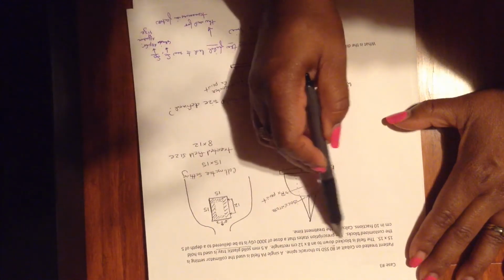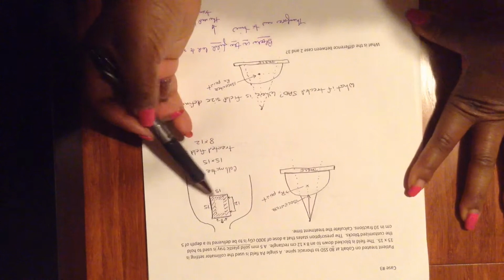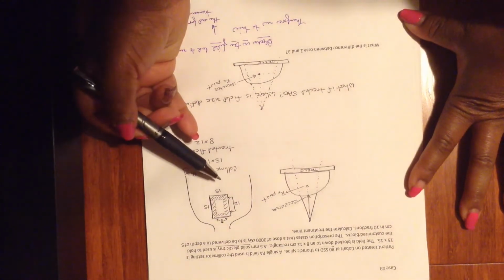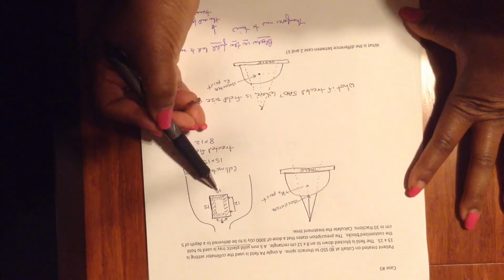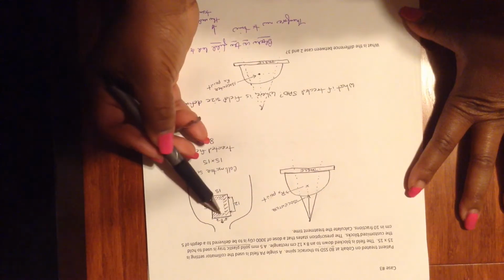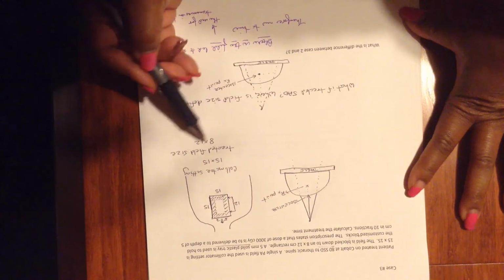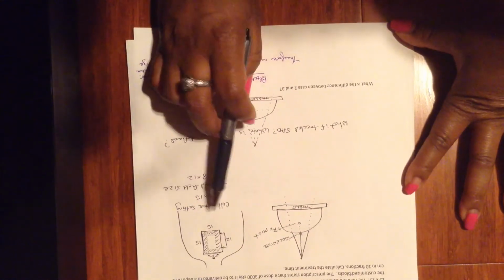But then there are blocks that we've created. We've created a shaped field by either cutting a custom block or by putting in standard blocks. So X and Y jaw are 15 by 15, but the block has been cut. So this is the area that's open. This is the area being treated. The area being treated is an 8 by 12. So here's how we're going to consider this blocked field in this similar condition.